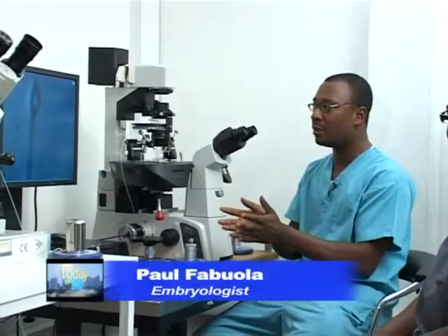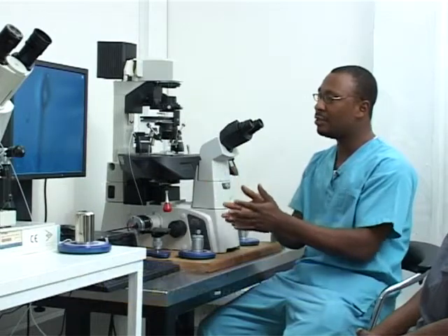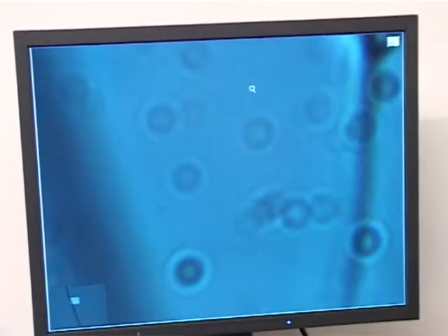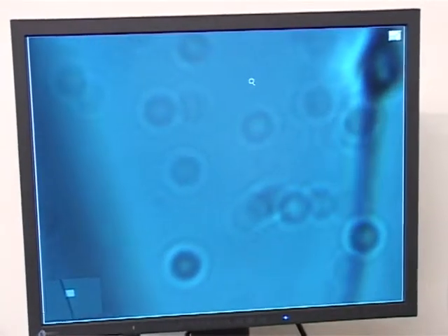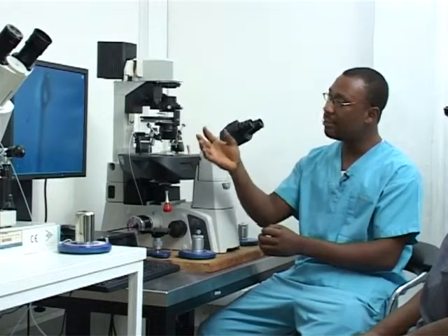In ICSI, we cannot really tell the sperm morphology because we can rarely see it under times 200 magnification. But in IMSI, the picture is bigger. We are able to see the morphology of the sperm cell very well. There are different structures that make up the sperm cell, and we analyze them one after the other on the IMSI machine because they are bigger and we can see them in detail. So we can tell a defective sperm cell from one that is not, because our intention is to select the best sperm cell that will give us a good quality embryo. That is what we are after. With the IMSI machine, we are able to see and select the best sperm cell to use for the treatment of the patient.